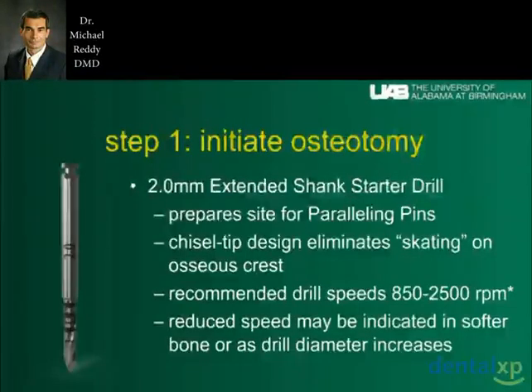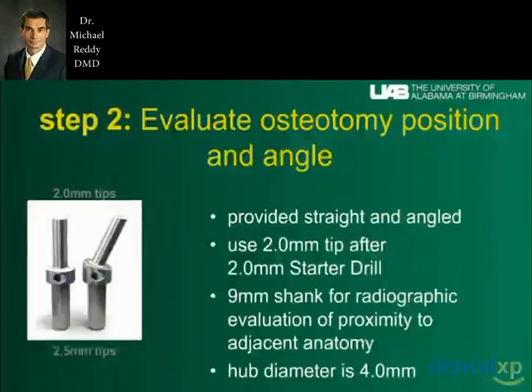So the steps involved then are to take the 2 millimeter starter drill and go ahead and place that in and make an initial osteotomy. Then the second step is to evaluate the angle and position.